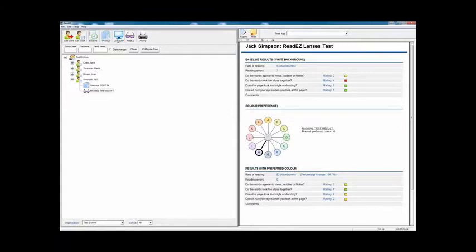You can do exactly the same for computer colors. Many people now spend just as long or longer looking at a computer screen than reading from a book. So you can actually change the background color of a computer screen either by changing the Windows colors or by downloading our virtual overlay software. That's a very brief overview of how the screening software works. Not only will it help you diagnose whether somebody is suffering from Meares-Irlen syndrome, it will help you determine the optimum color for a ReadEasy overlay, for a ReadEasy clip-on or spectacle lens, or for their computer screen. It will also maintain a database of all your results and will allow you to generate quite a wide variety of reports.